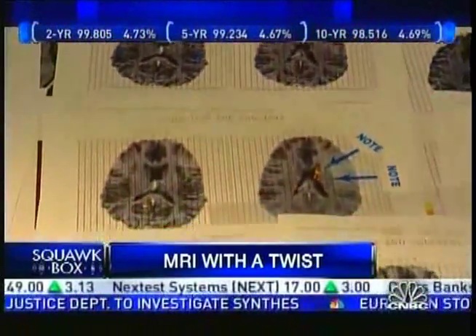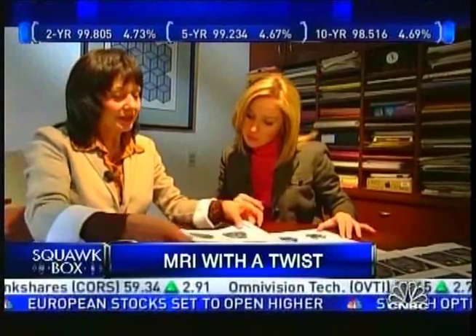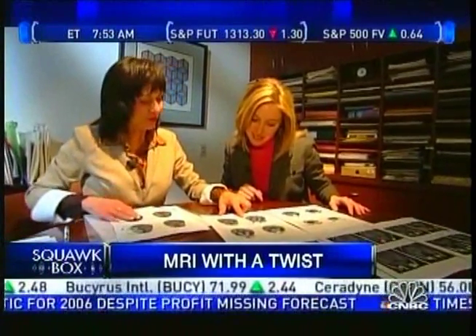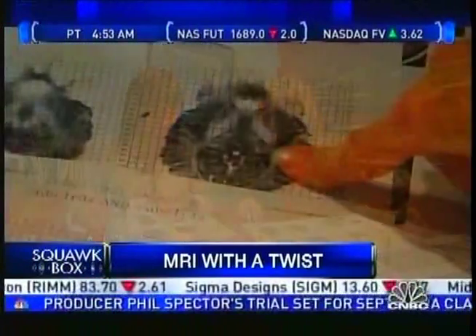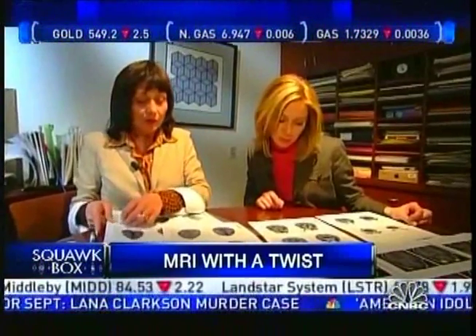So we would expect to see your visual system. Right. It's loud and clear. The visual system is active, and this is Wernicke's area. This is your speech area. So I'm actually thinking. I'm thinking words to myself. That's right. You're thinking words to yourself. You're talking to yourself. Your language system is loud and clear. And as we're moving up through the brain, we see just the minimum amount of activity that we would expect.